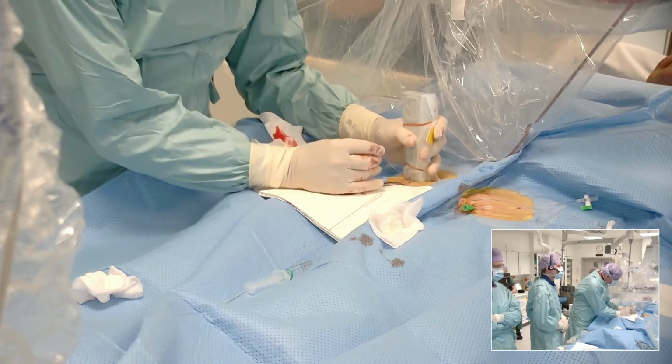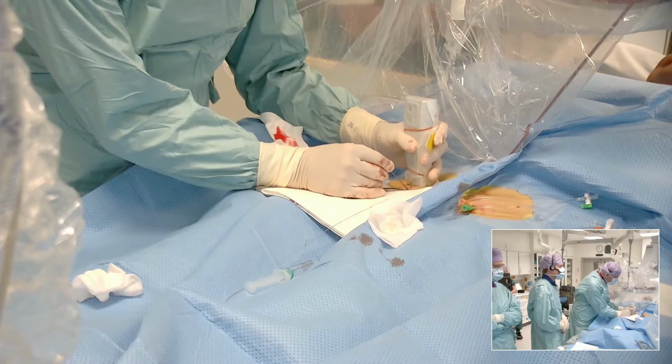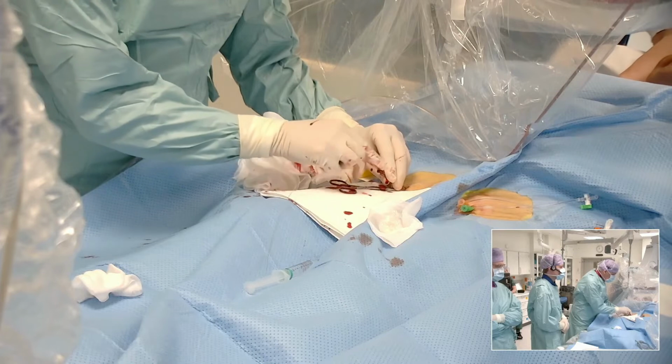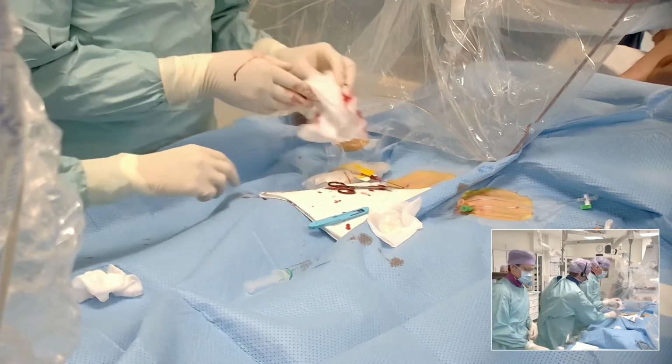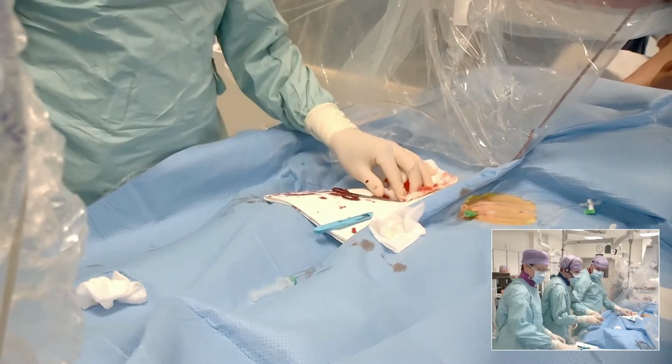So I will just, and we see we have in the middle of the vessel here a place with no calcium, so we have a better chance that the closure device is going to work. I'll give you the needle, Ole.